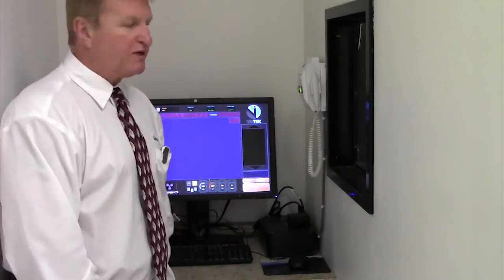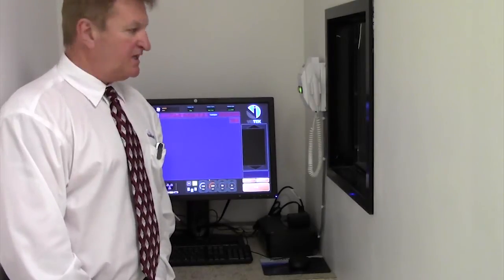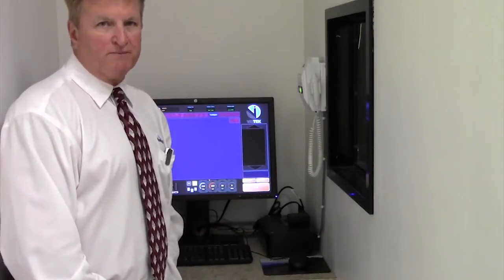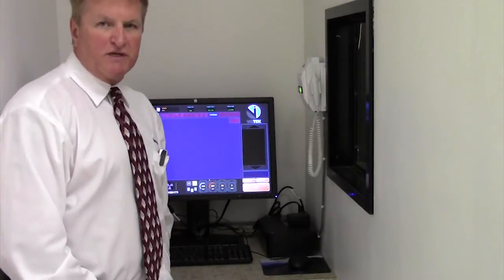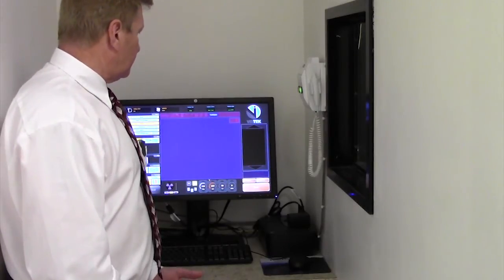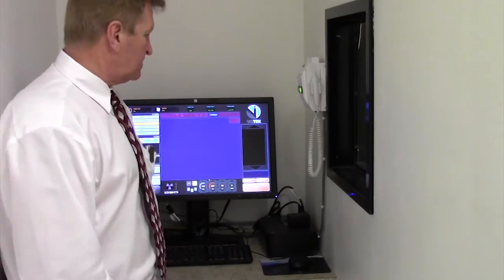To make an exposure, there's a two position hand switch. The image is acquired in approximately four seconds. Once the image is acquired, you have the tools to manually shutter. You can review the exposure index using the standard exposure index numbers, as well as a repeat analysis for any rejected images that are kept in the system.